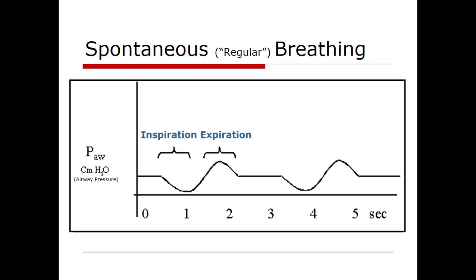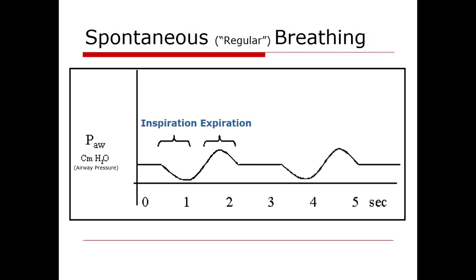All right, so to understand the modes, you have to think about how we're all breathing right now. I don't think anybody in the room is intubated right now. So when you take a breath in, you drop your airway pressure, and when you exhale, the airway pressure goes up. So if I intubated your chief resident, Maria Latz, up there, and measured the airway pressure versus time curve, when she breathes in, her airway pressure would go down. When she exhales, it would go up. Okay, that's the normal physiology. And on all of our ventilators, you will see at the top of it an airway pressure versus time curve. And you can see what's actually happening as described.